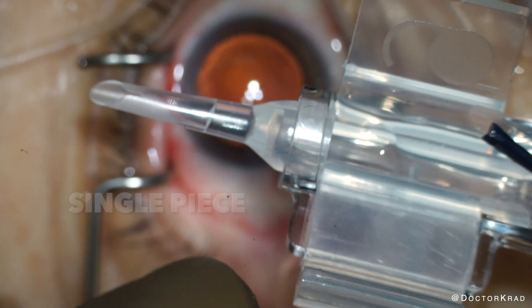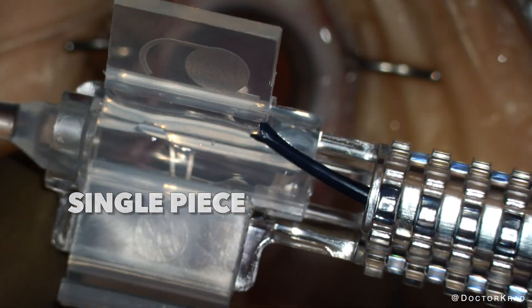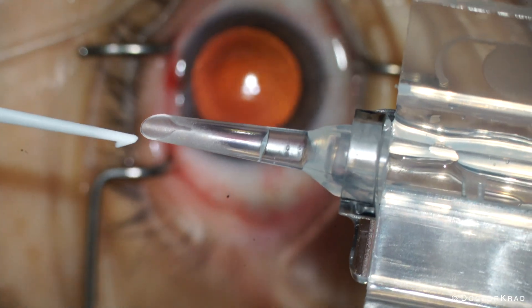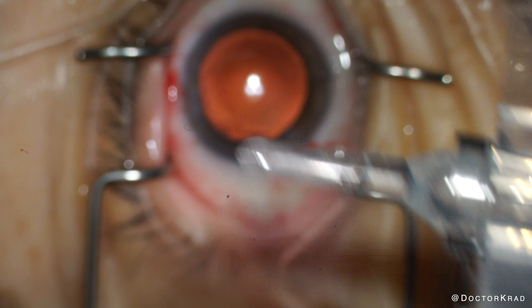This injector is version 2. I don't have an RX-Site staff member walking me through this — I want to see how intuitive it is, so I'm figuring it out on my own. The injector and cartridge are now one single piece, and they include this white plastic hook to retrieve the leading haptic in the nozzle, just in case it's folding on itself.